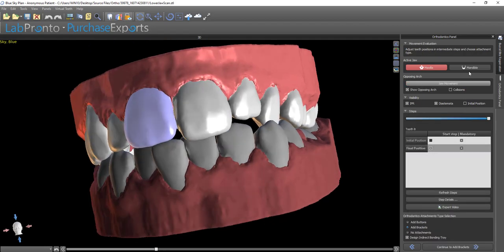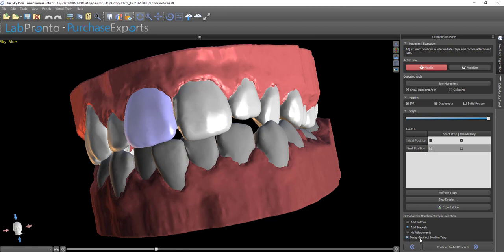Now, in the Edit Steps panel, we're not going to edit the steps because it's not relevant since we didn't move the teeth. We're just going to click Add Brackets — the radio button on the bottom right. We can also click the box for Design Indirect Bonding Tray, and then continue to Add Brackets.